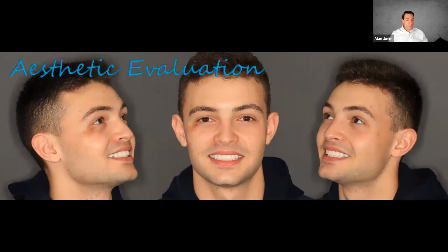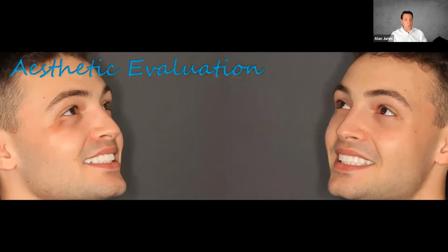And once we try it in, we do the right photography so that we can analyze it. In fact, if you look at the patient's right canine, to me, it looked a little bit long. So I knew that was something I was going to need to adjust. But it also explained to the patient what our vision was. And then the patient feels more confident. We know exactly what we're doing before we ever actually do it permanently.